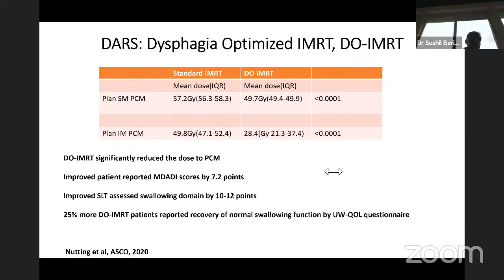You extend your isodose line beyond the skin so that, with day-to-day setup and uncertainty, you're not missing the target. Because otherwise, you have a conformal plan, there's no flash, so you may miss part of the node if you do not have an auto flash built in. Either you can use the bolus if the skin is a risk, but if skin is not a risk, and you are concerned about day-to-day setup and uncertainty, use the auto flash module in the treatment planning system and ask your planner to extend the isodose line into the air in that area, so you don't miss the node with day-to-day setup and uncertainty.